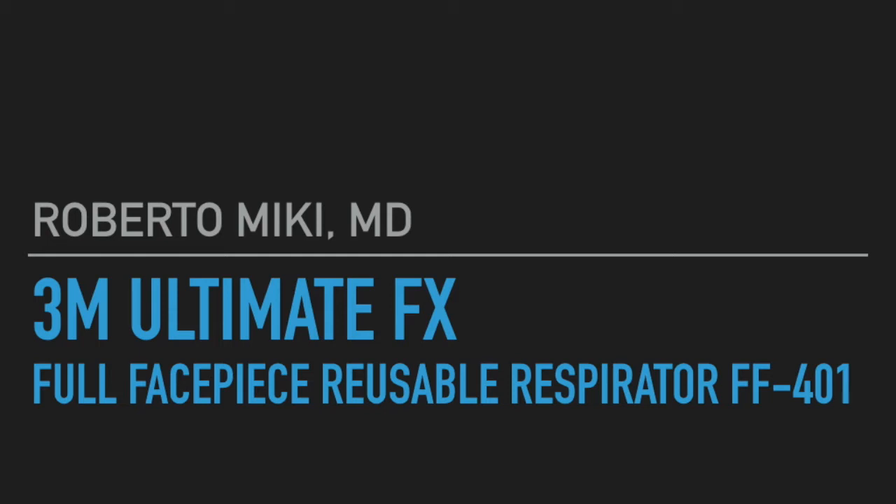Hi, it's Roberto Mickey, and we're going to be showing some testing that we did on the 3M Ultimate FX Full Face Piece Reusable Respirator FF-401.